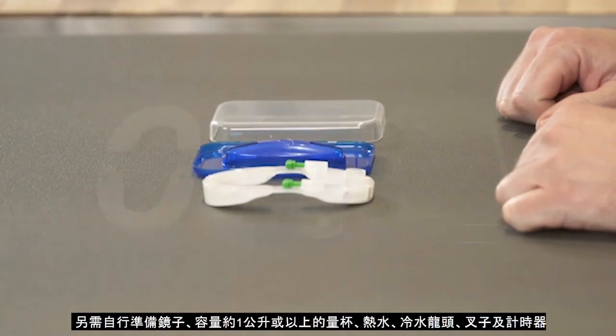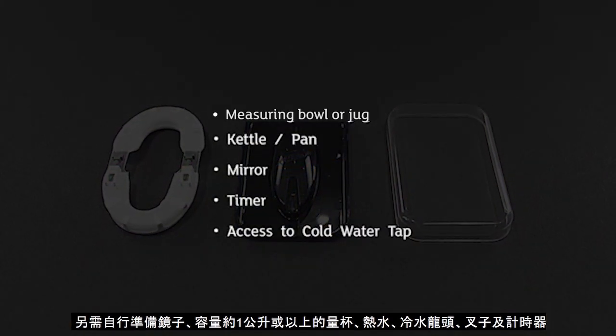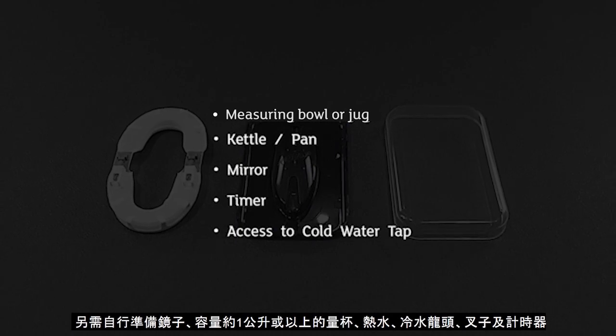You also need a measuring bowl or jug, a kettle or pan to boil water in, a mirror, a timer and access to a cold water tap.